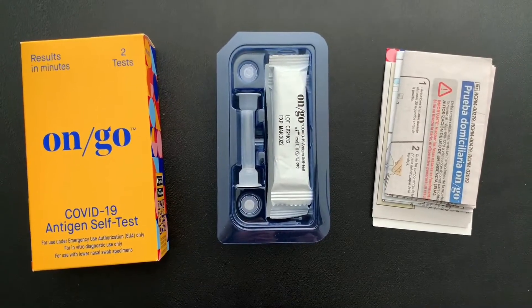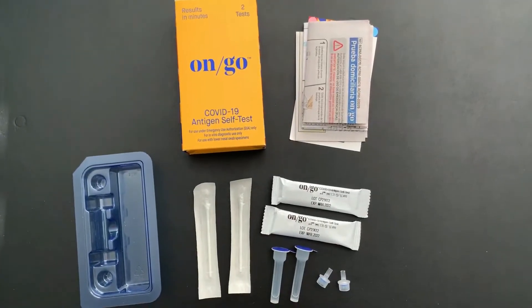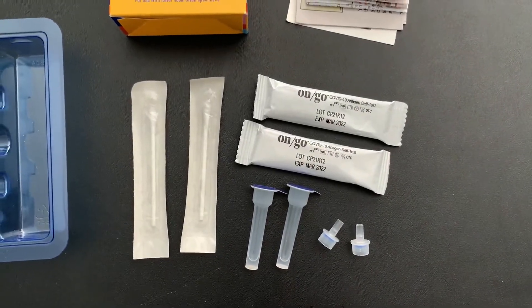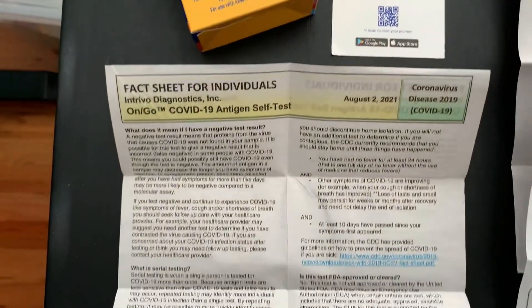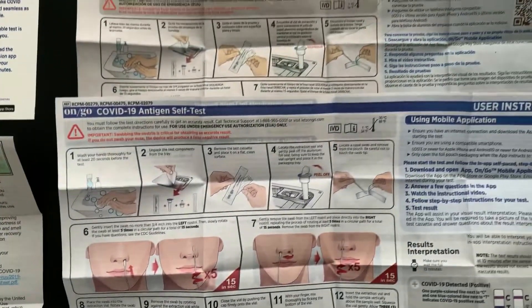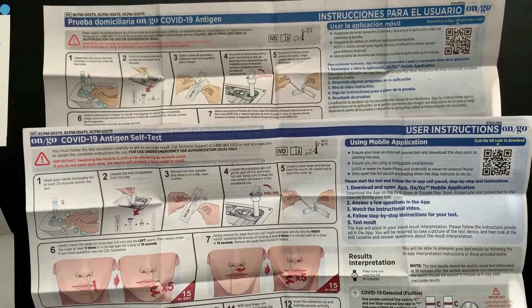Here's a quick look at everything that comes inside the package. Once you unpack things, you'll see you have a set of two of everything so that you can do this test two different times. Each box comes with a little pamphlet telling you how to log into the app, a fact sheet along with very clear, user-friendly instructions in both English and Spanish.